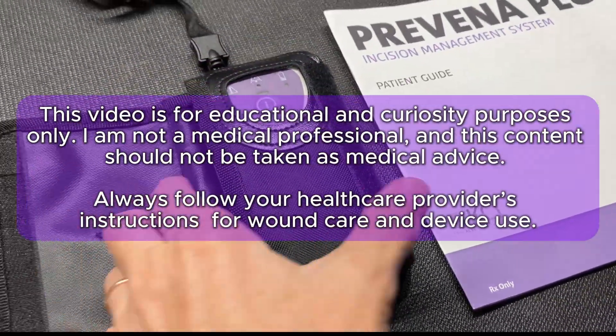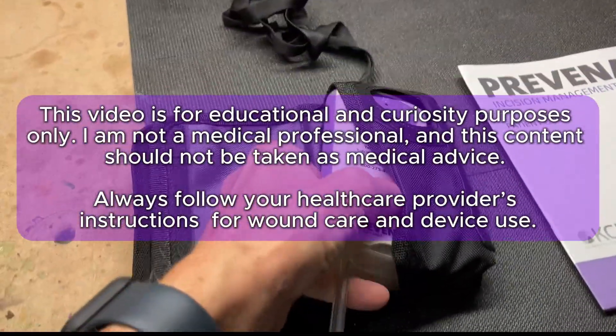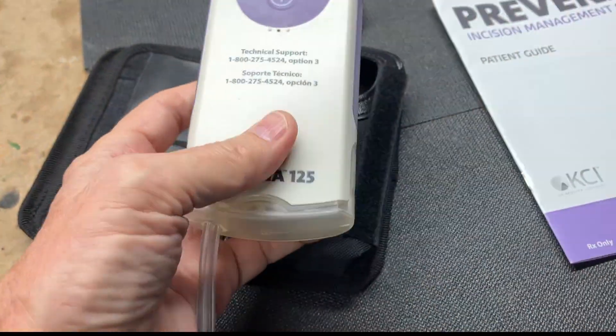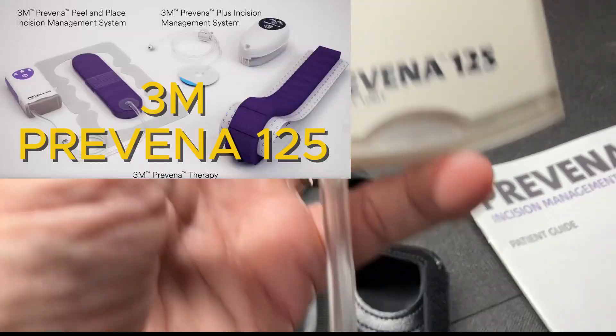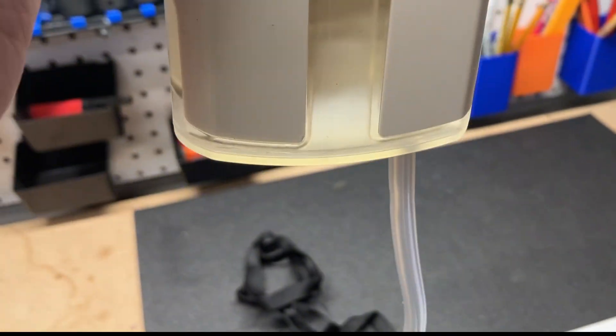Time for a disclaimer. I'm not a medical professional and I'm not offering medical advice — zero, zilch. I simply want to know what's inside this unit. Your medical stuff should be handled by you and your doctor. The unit we got is the Preventa Plus incision management system, looks like a model number 125, and I'm sure there are many others on the market.